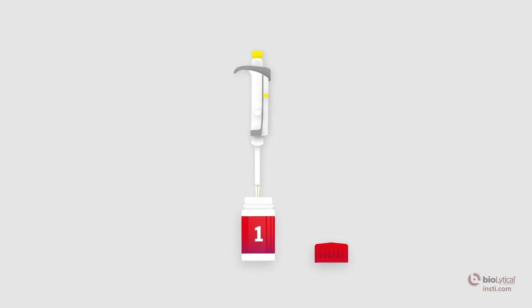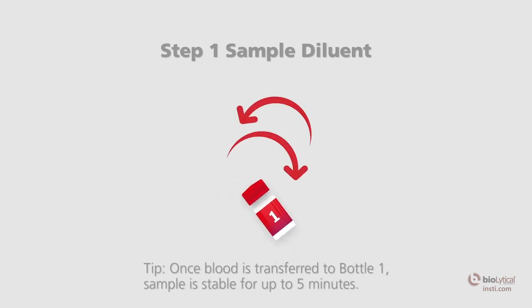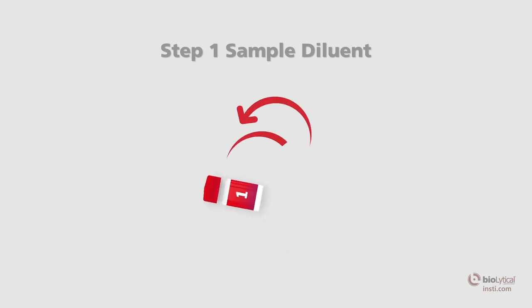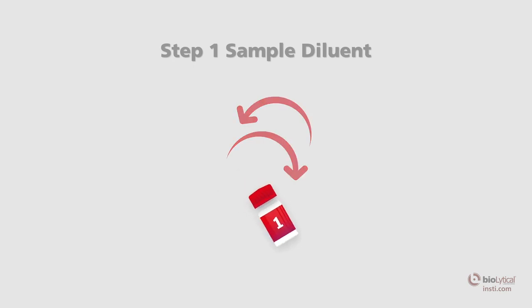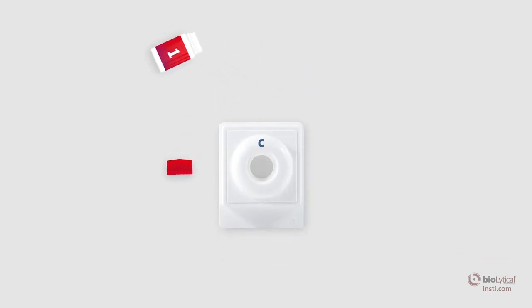Transfer the plasma held in the pipette to bottle number one, the sample diluent. Once the sample has been transferred into bottle number one, recap the bottle and mix well by inversion. Open the sample diluent and pour the entire contents into the center of the membrane unit well. The sample should be absorbed quickly. Wait for all the liquid from bottle number one to be absorbed completely.